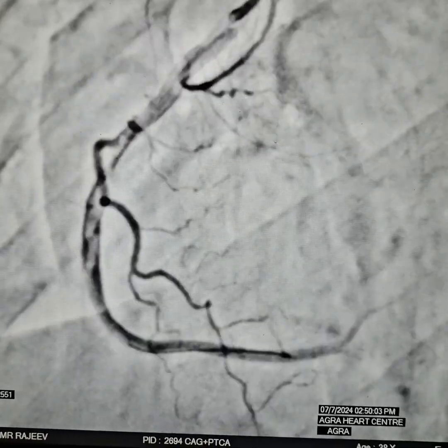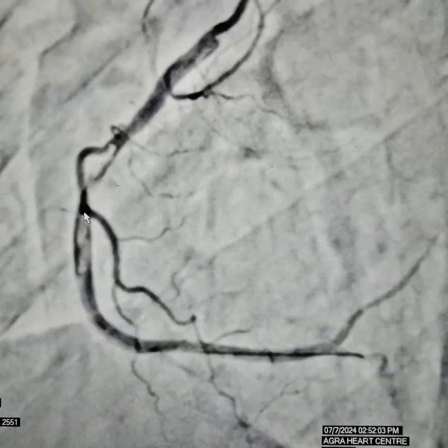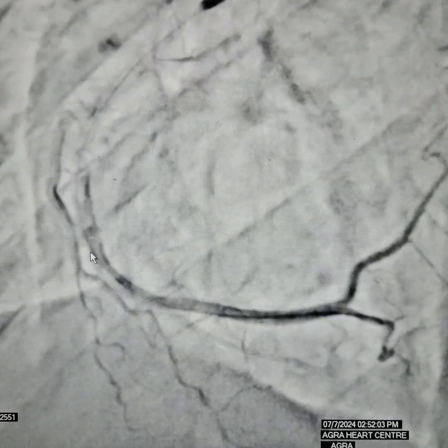Now you can see a lot of organized thrombus right here — huge thrombus burden. In such a large thrombus burden, there are 2 technical challenges. First, thrombus aspiration does not usually work in an organized thrombus like this. Second, there is a lot of risk for distal embolization and getting inadequate results. So what do you do? Stent it. Put the patient on Clexane, antiplatelets, tirofiban, whatever. Just stent it to the wall. Put a stent across it — that's the best strategy.